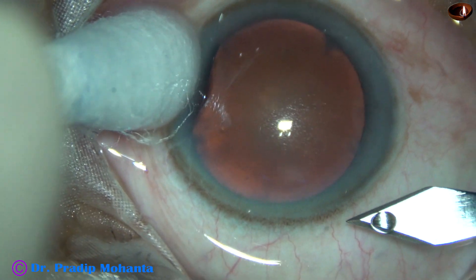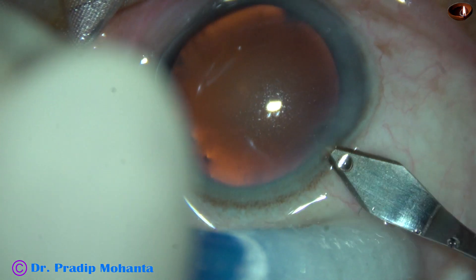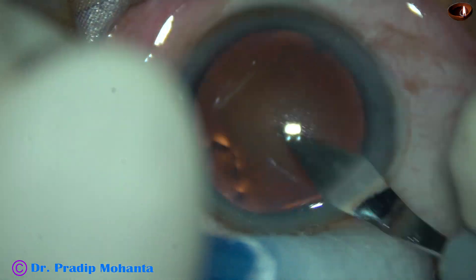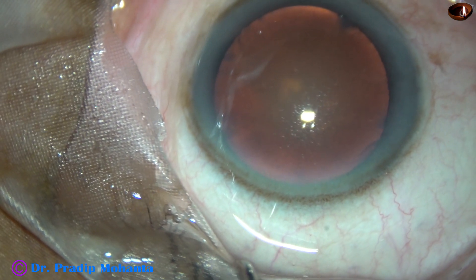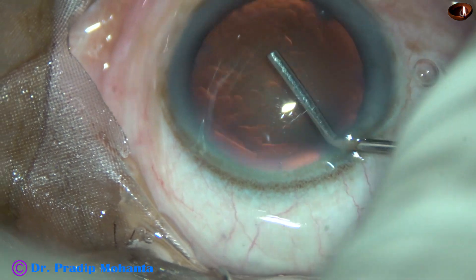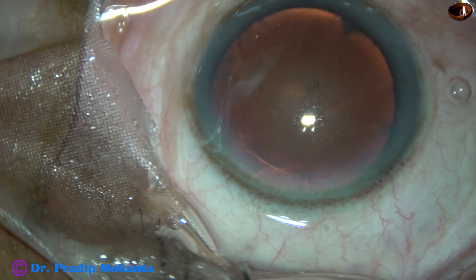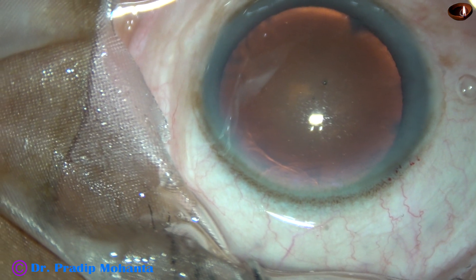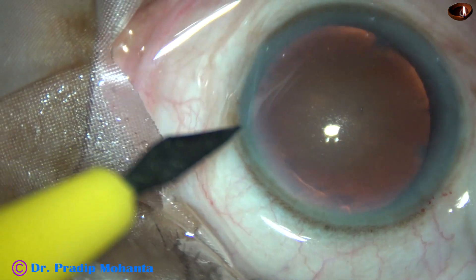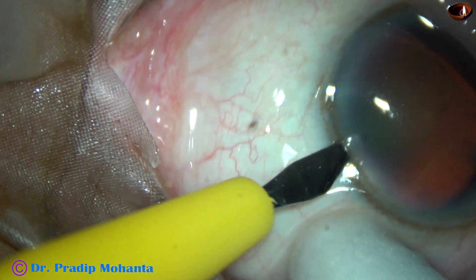This is the main incision with a 2.8 mm keratome on the posterior aspect of the limbus. In this case, I am going to do only one side port. This is visco filling up the anterior chamber. A side port is being made on the left side of the main incision, about 3 o'clock hours away.